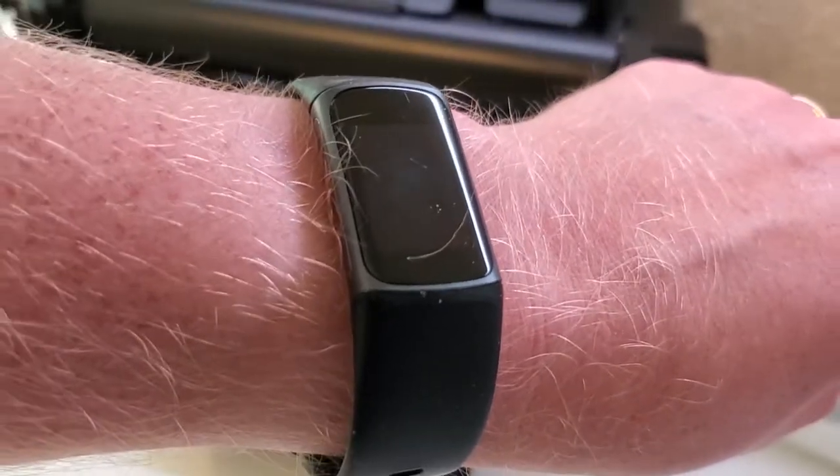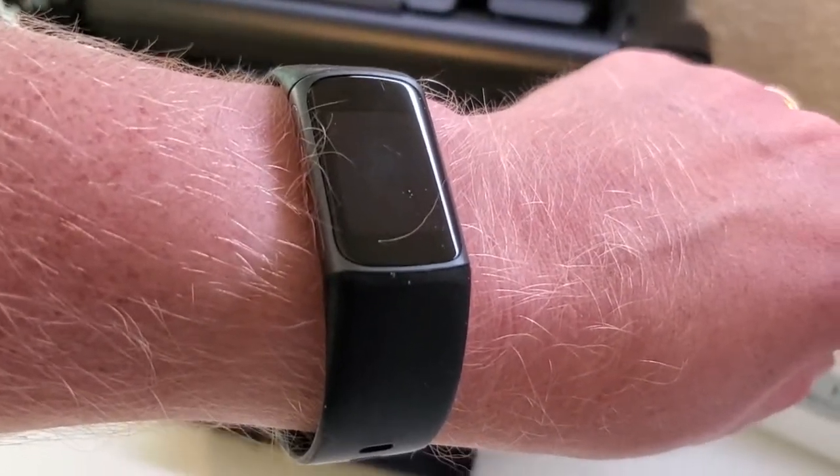I'm Tom from DIY Life Tech, and this is a look at how to take an ECG reading on your Fitbit Charge 5.